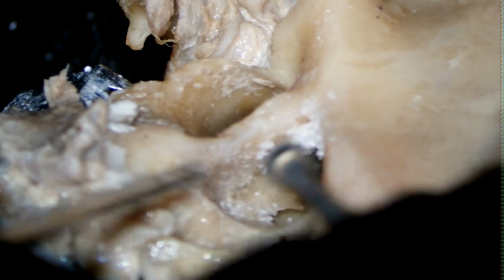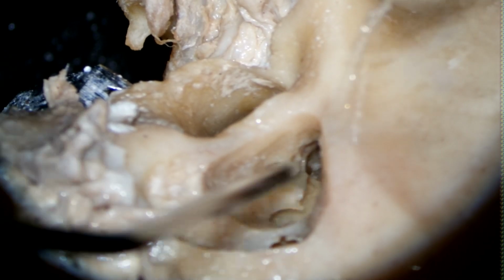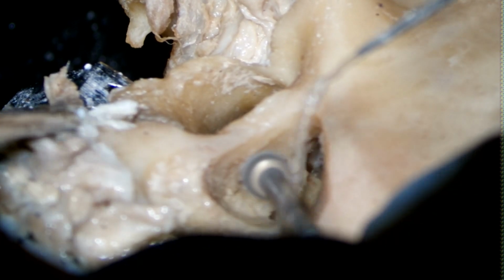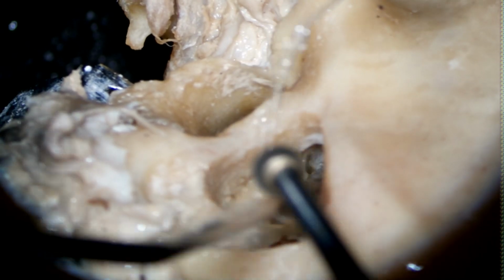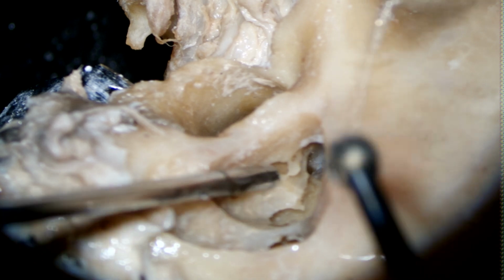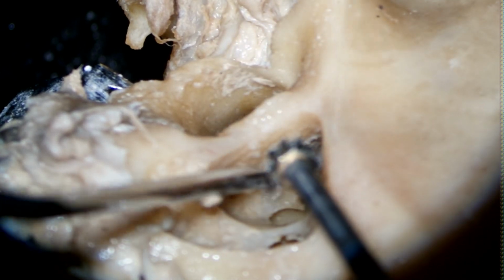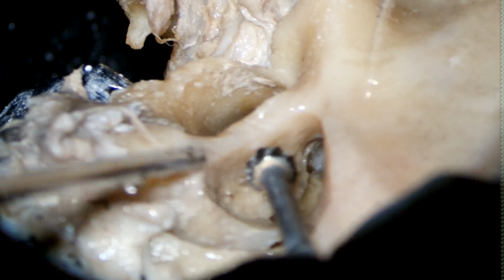Otherwise, what will happen? When you're doing posterior tympanotomy, you can go very much posteriorly and medially and can damage the facial nerve, right? So basically, we are making the canal wall thin so that the facial nerve becomes more posterior, and it is medial.